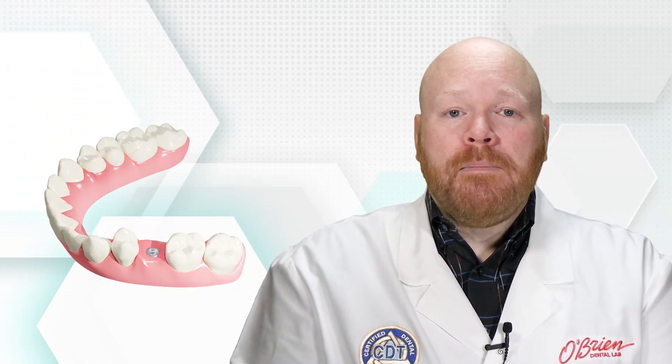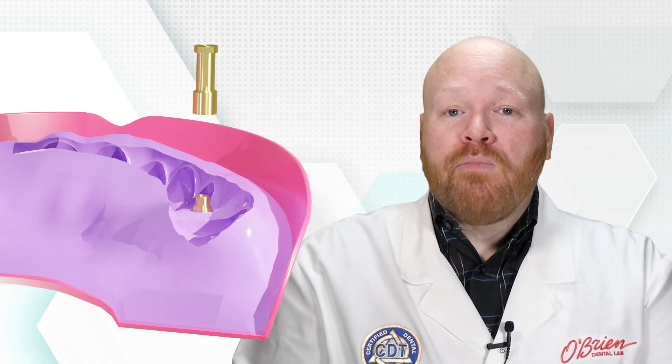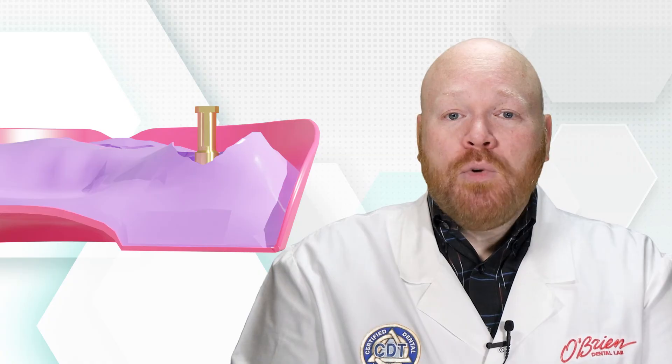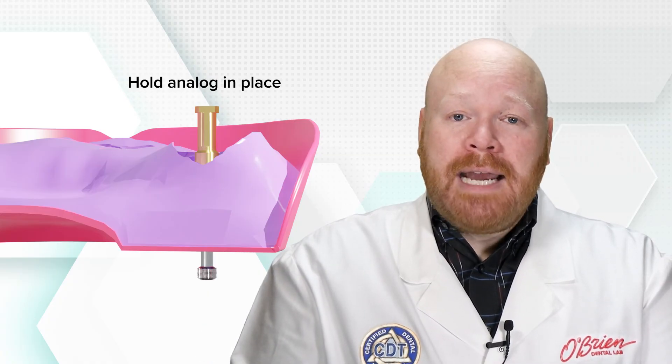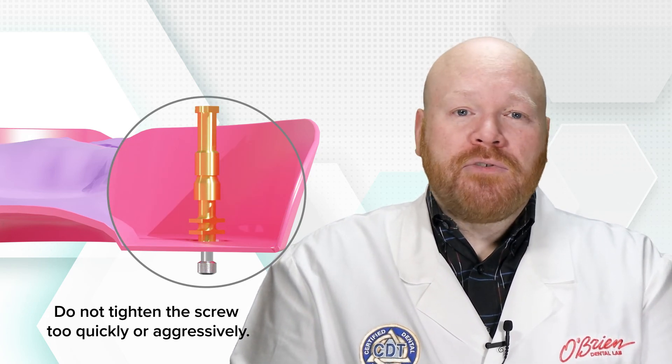Once the impression material has set, you'll unscrew and remove the impression coping screw and then pull the tray from the mouth. Your lab can attach the analog to the impression coping when they receive the impression, but if you want to attach it yourself, it's important to prevent the impression coping from rotating inside of the tray. This can be achieved by first attaching the analog completely to the impression coping, making sure that it's fully seated. As you hold the analog in place, slowly and lightly tighten the screw. If you tighten that screw too quickly or aggressively, the impression coping will start to rotate as soon as the screw is completely tightened.